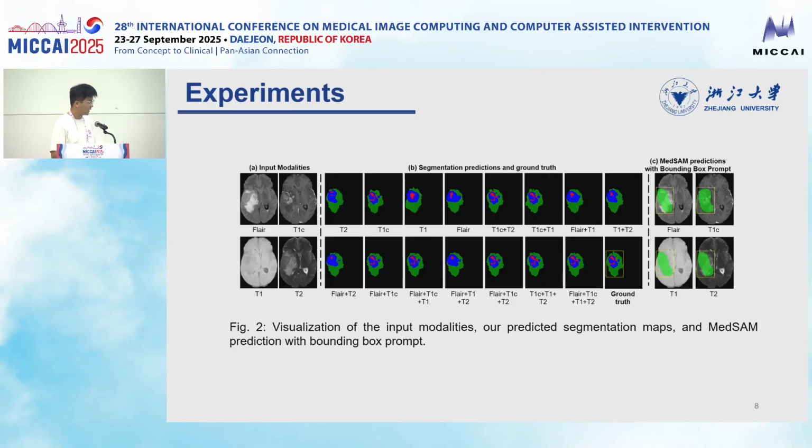And on the right are the results from MedSAM. It is worth noting that medical foundation models such as MedSAM still fail to do well even when provided with the bounding box of the tumor. This further stresses the significance of our approach even in the era of foundation models.